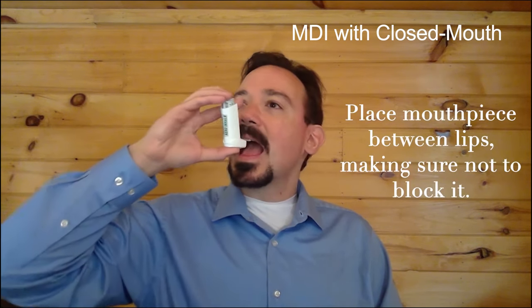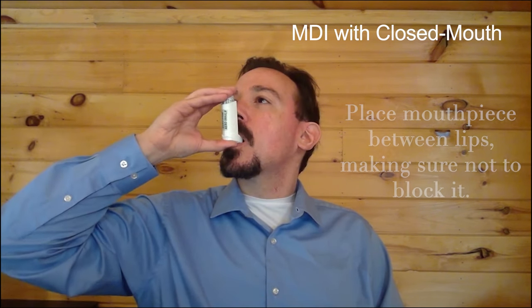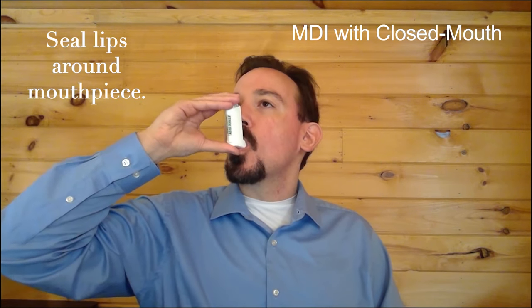Place the mouthpiece between your lips, making sure that your tongue is under it and not blocking the mouthpiece. Seal your lips around the mouthpiece.